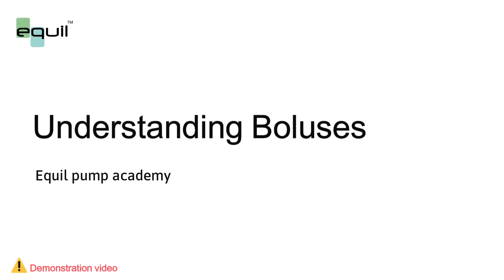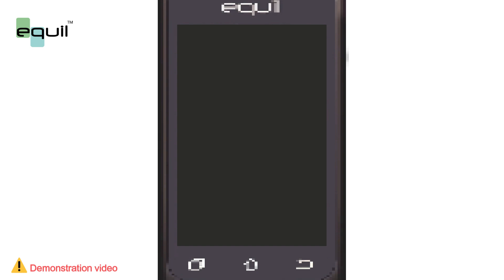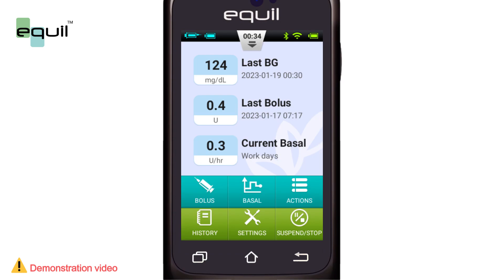In this video, we'll learn how to adjust the bolus delivery for Equil Insulin Patch Pumps.